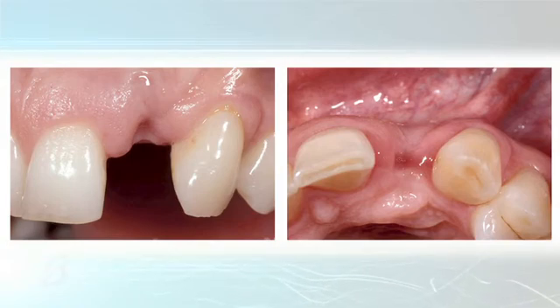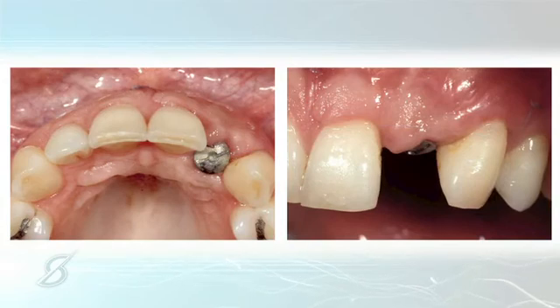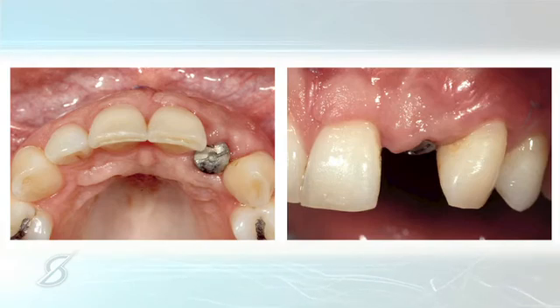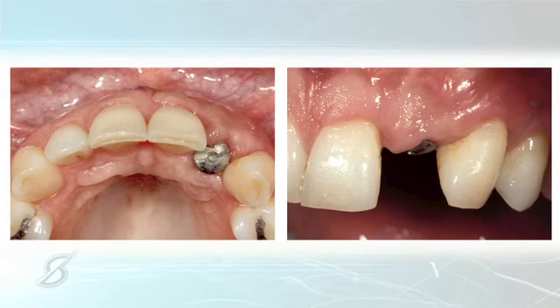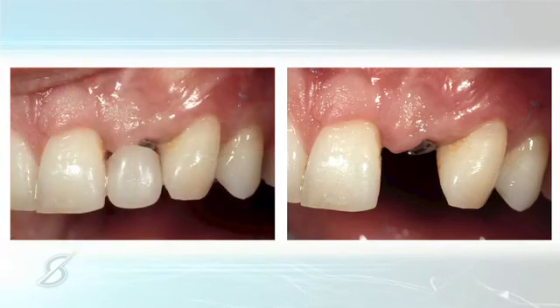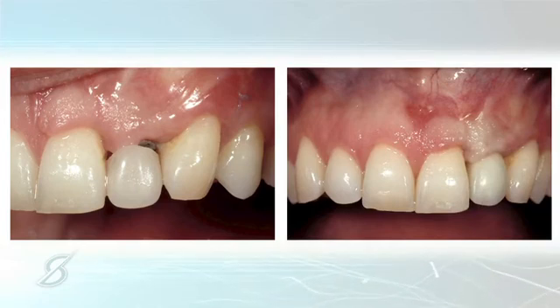I'm not going to go through all the steps in the process, but he did a beautiful job of overbuilding the tissue. So when I saw her back, she now has the implant, she has a healing abutment, and she has a lot of gingiva. My goal is now going to be just what we got done doing on all those other patients. Make an impression, make a model, carve the tissue, make a temporary, put it in place. She's been wearing a flipper that's been shortened significantly up off this tissue, and so we have a lot of excess tissue.